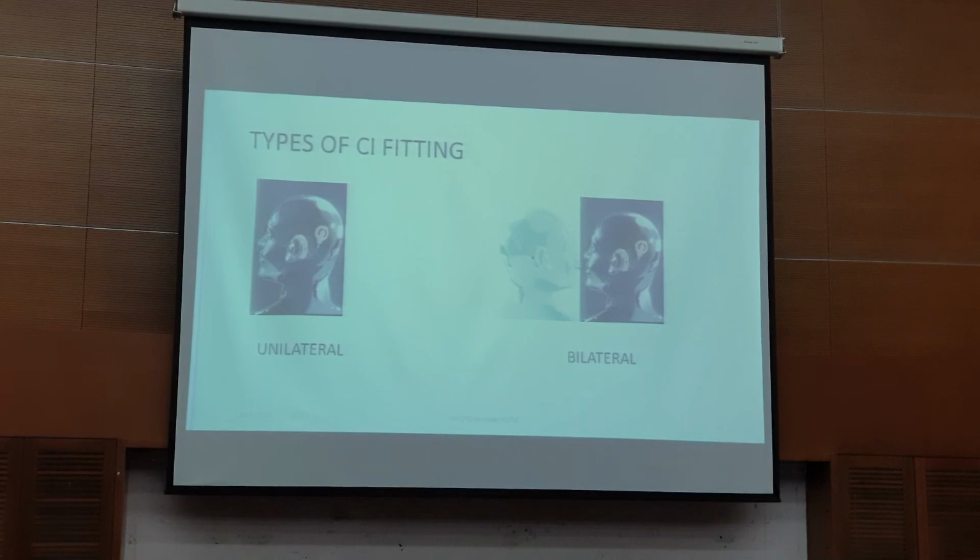Then since 2008, UKM started with bilateral CI, for those with significant bilateral losses. But as the criteria evolve, now we are implanting those with more residual hearing.